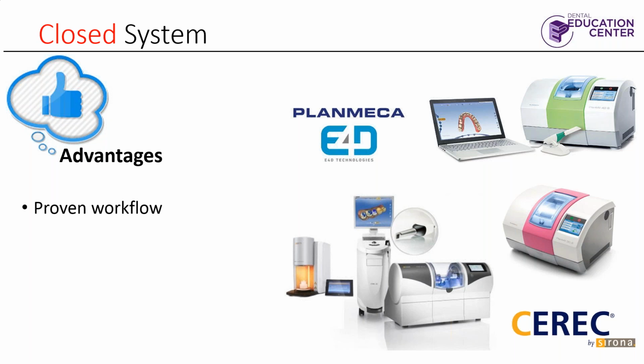It's a proven workflow. I mean, CEREC is the grandfather of chairside milling. Back in the mid to late 80s, Dr. Crispin, who owns Aesthetic Professionals, was, I think, the fourth CEREC trainer. Yeah, it was back when CEREC was owned by Siemens. He was playing with this equipment back then, and it had some pretty good results.